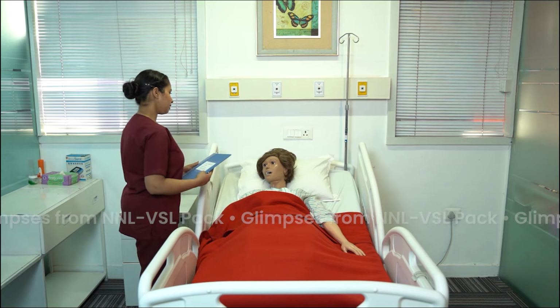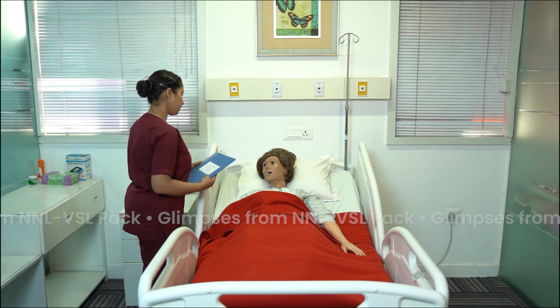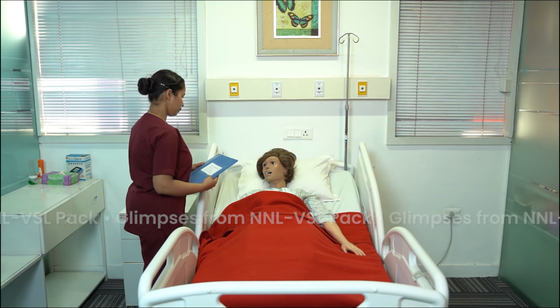Ma'am, as your doctor has prescribed some of the IV medications for you, so for that there is a need of putting an IV cannula. Kindly cooperate during the procedure.